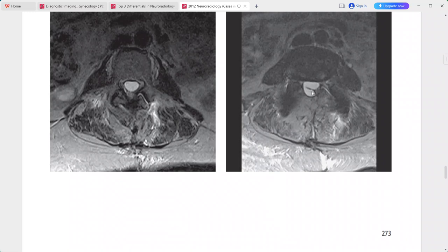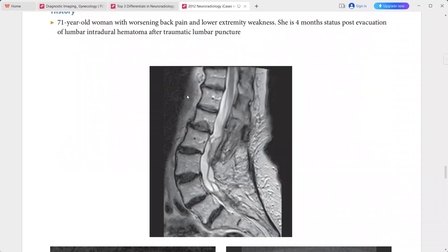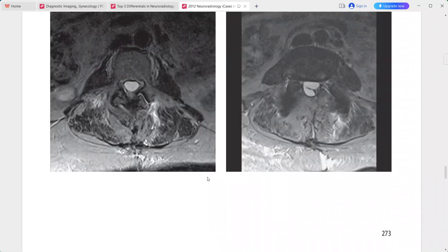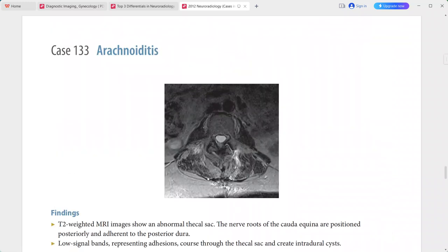This is a case of arachnoiditis. In the differentials you can include intradural mass such as myxopapillary ependymoma, metastasis, and spinal stenosis with apparent nerve root clumping.